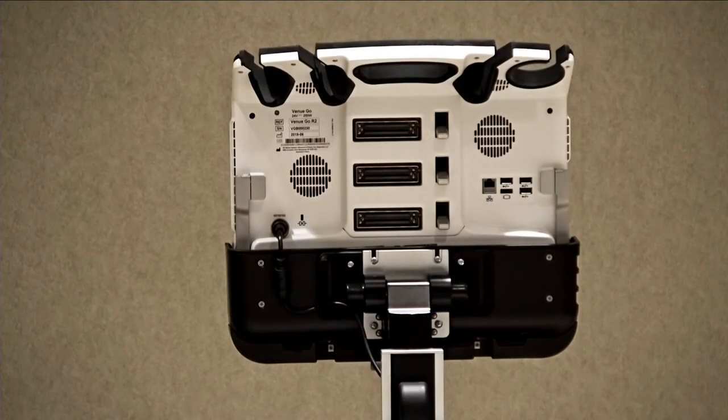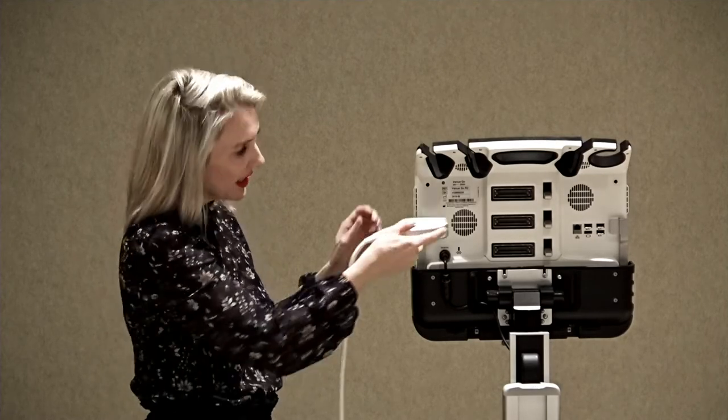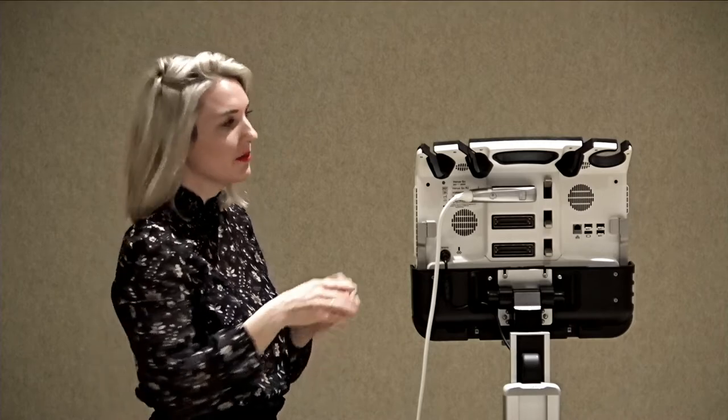The Venue Go has three probe ports on the back of the system. To connect a transducer, insert the probe into the port, then lift the lever to lock it into place. To remove the probe, lower the lever, then pull it straight out.